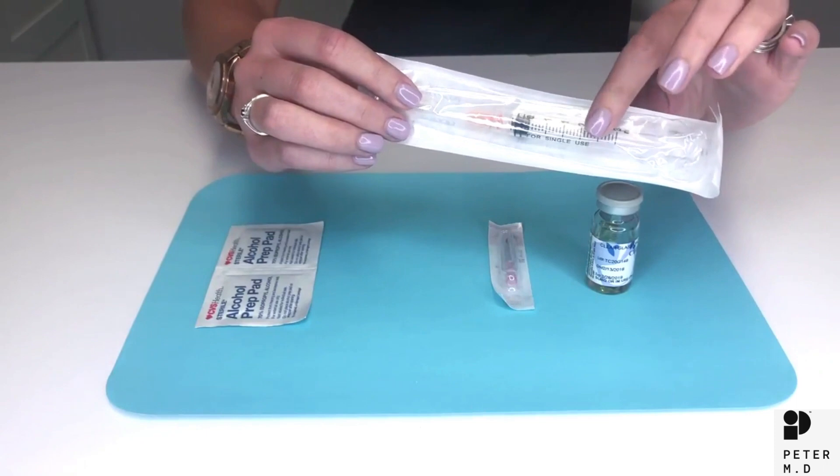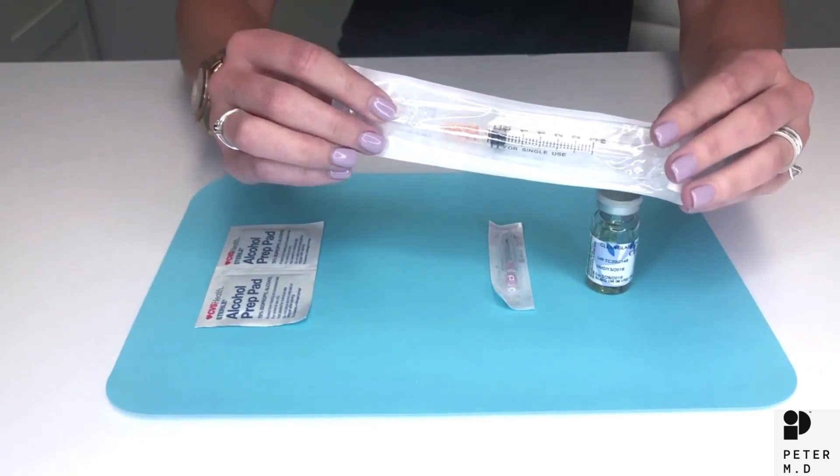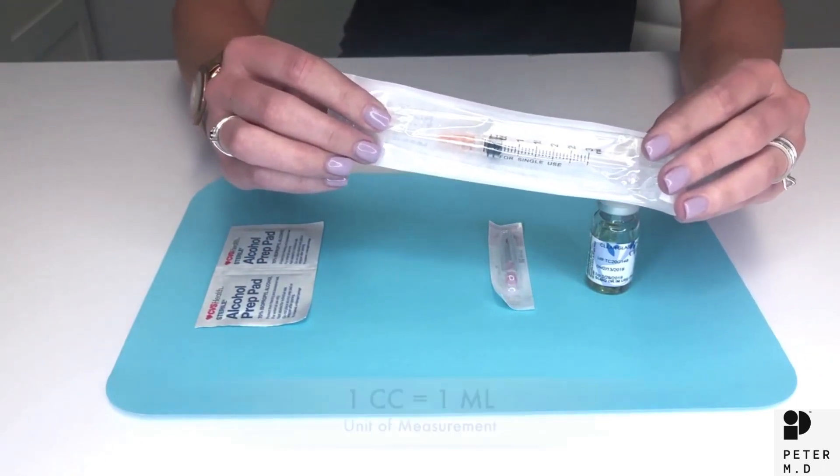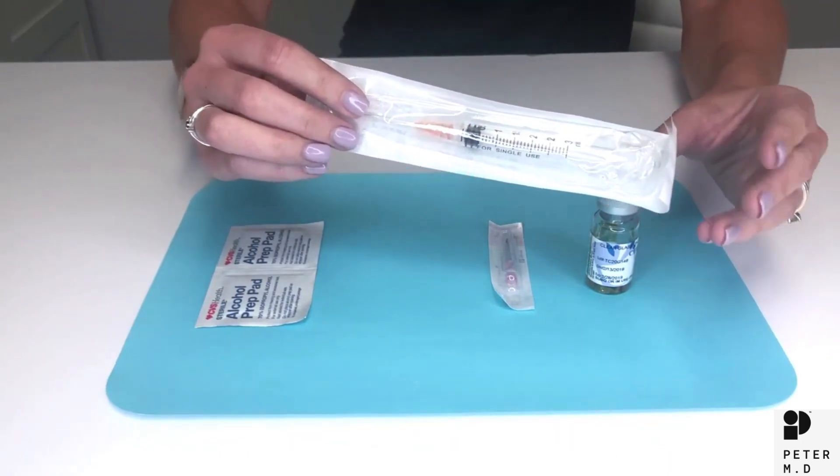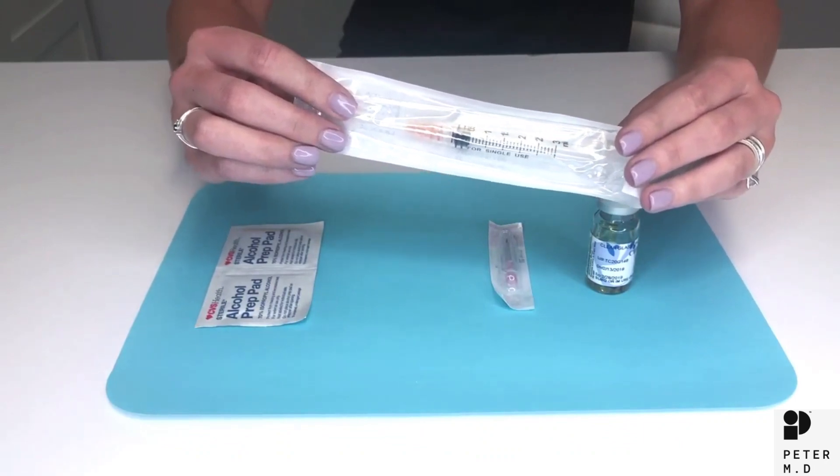When we refer to the syringe we refer to the volume that it holds. Just to be clear, a cc and an ml are the same unit of measurement, so a 10 cc syringe is the same as a 10 ml syringe.